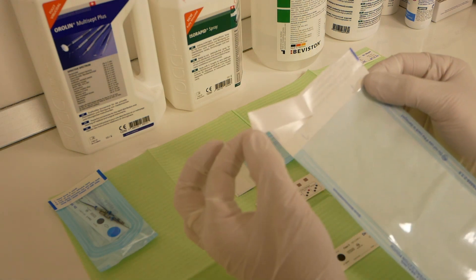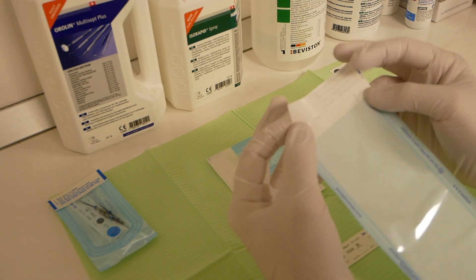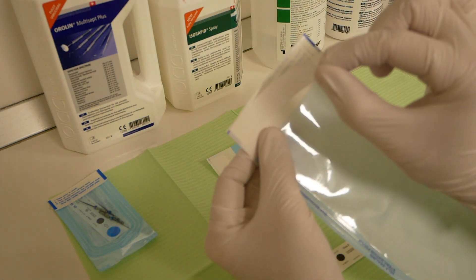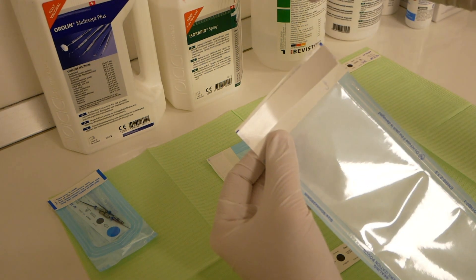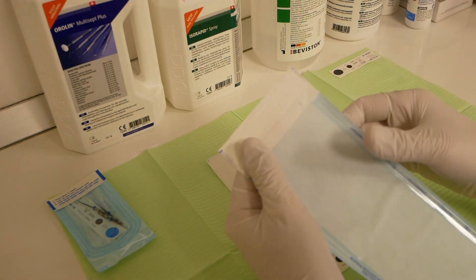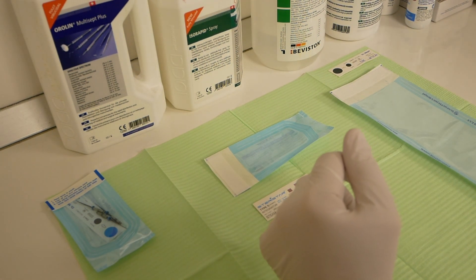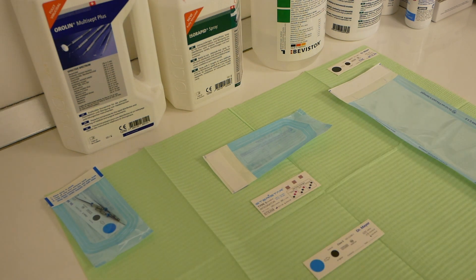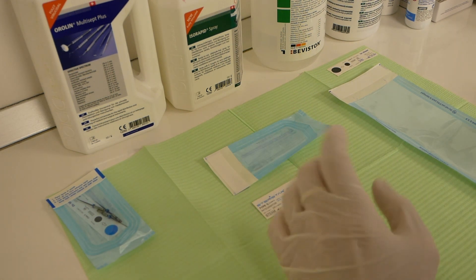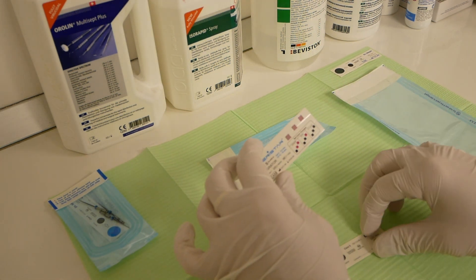There are also some variants that have the Class 5 indicator as a strip. When you peel the adhesive strip to seal the pouch, the bag has the Class 5 indicator here — you peel it off, write the necessary information on it, insert it in the bag, and proceed with the sterilization process.